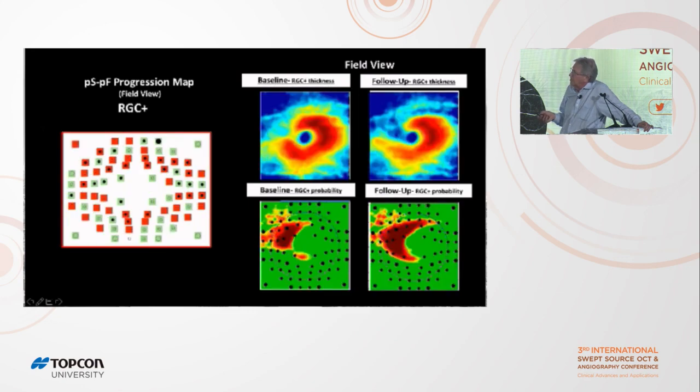All right, so here's the ganglion cell map for the same patient. There's, again, a cluster of agreement, and you can see it's there to there. Well, you may or may not believe it if you only had that, right? And there to there. Here's the cool part. There is a cluster of agreement. That's now going from those two regions from here to here, right? And maybe you can sort of see why.